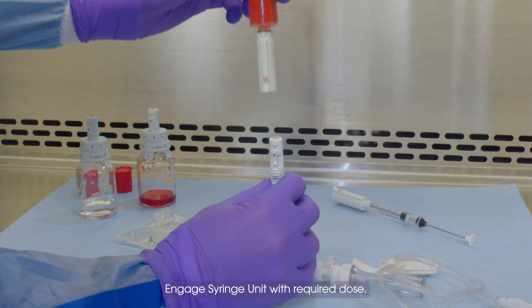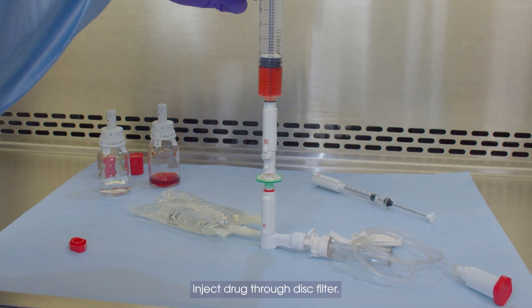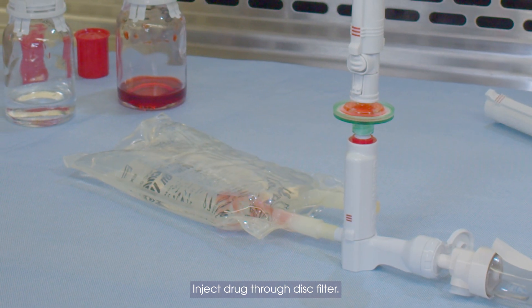Engage Syringe Unit with Required Dose. Inject Drug through Disk Filter.